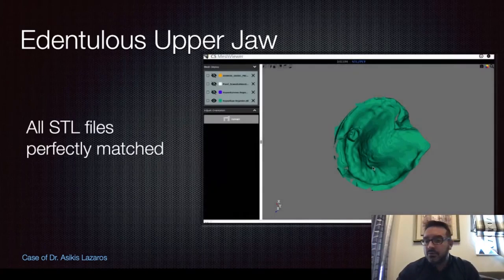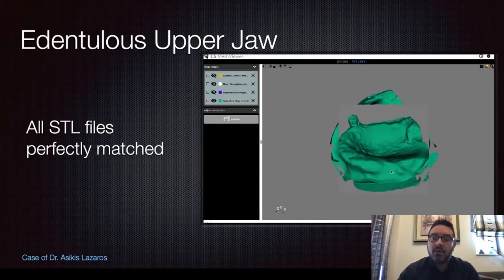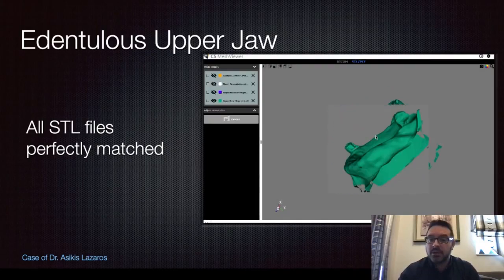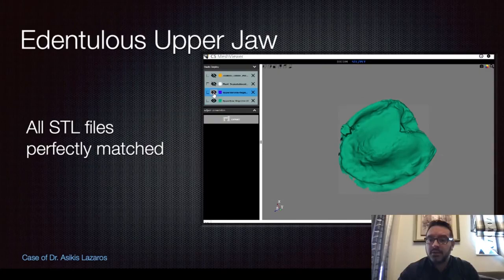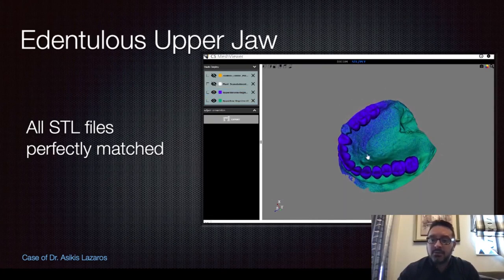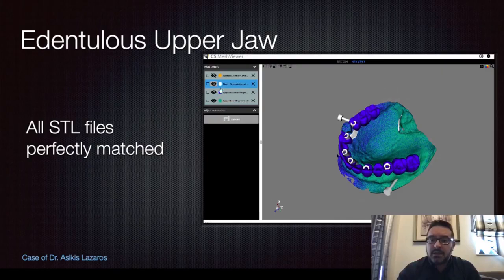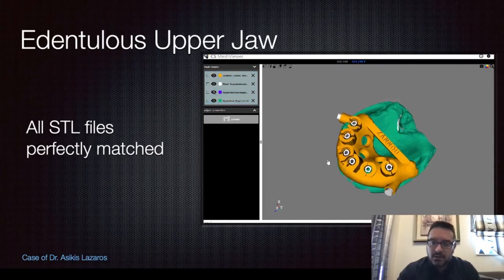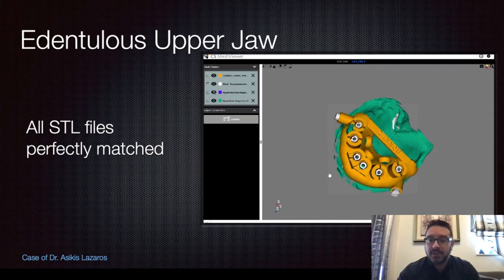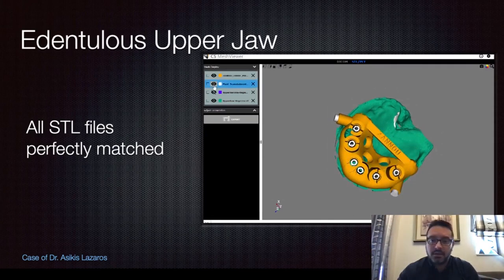Before going to choose the Octa abutments, I will show you how all STL files are perfectly merged. This is the initial STL file from the jaw of the patient. This is the provisional that we took from the lab. These are the scan abutments that came out from the hardware software. And this is the final STL file that we get for the surgical guide. As you can see, there is a perfect fit if you overlay one STL over the other.